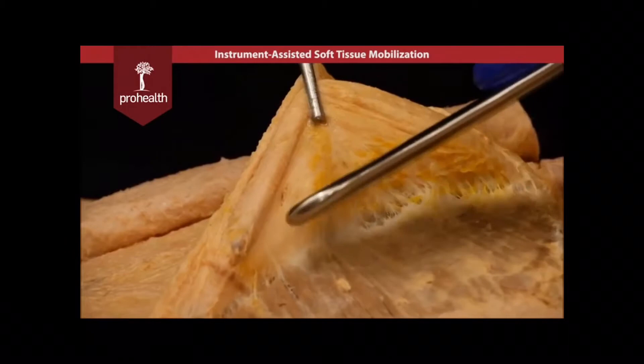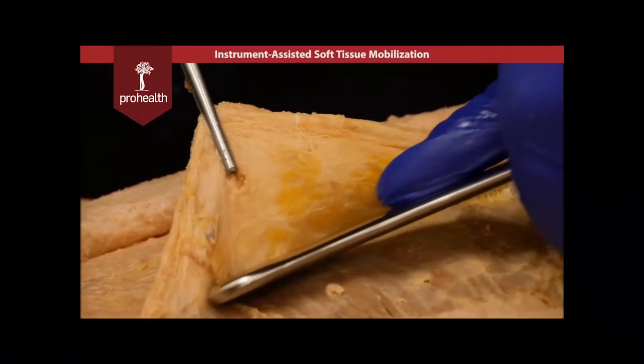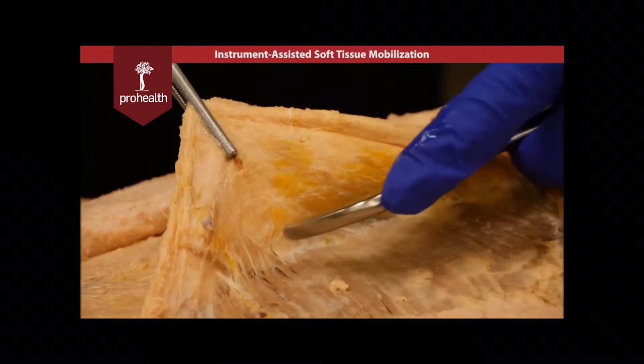Here we have a cadaver demonstration of some instrument assisted techniques working on the superficial fascia. On the lower part of your screen what you're looking at is actually the muscle. On the upper part of the screen you're seeing the superficial fascia being reflected back.